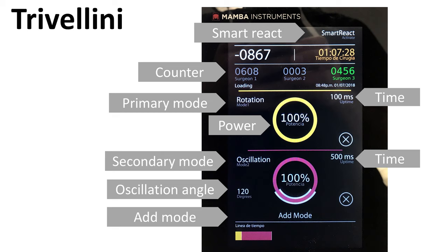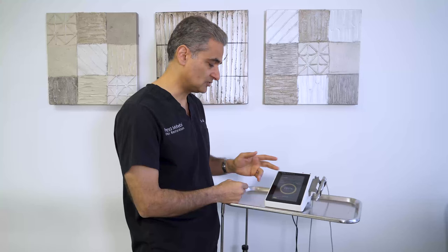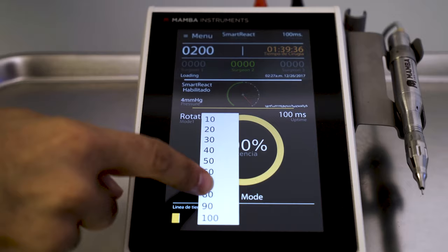We can go to different phases. This bottom part shows you what rotation, oscillation, or vibration we are using. If I click here, the first thing you can see is rotation. You can change the rotation level to 100%, 80%, or 30%.